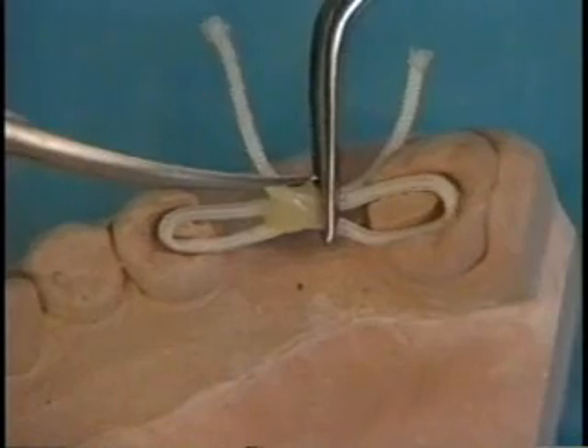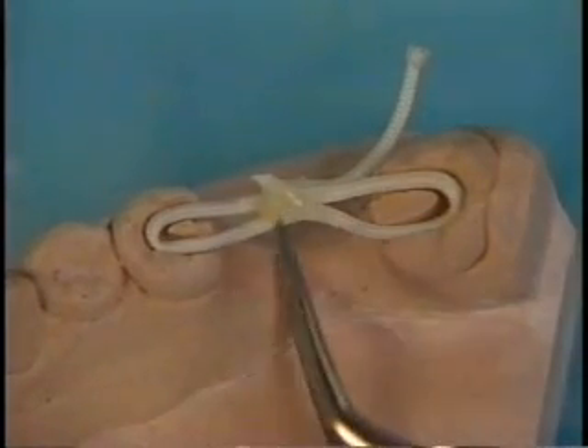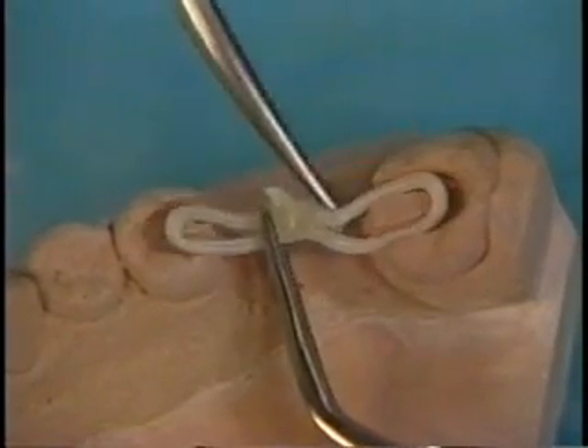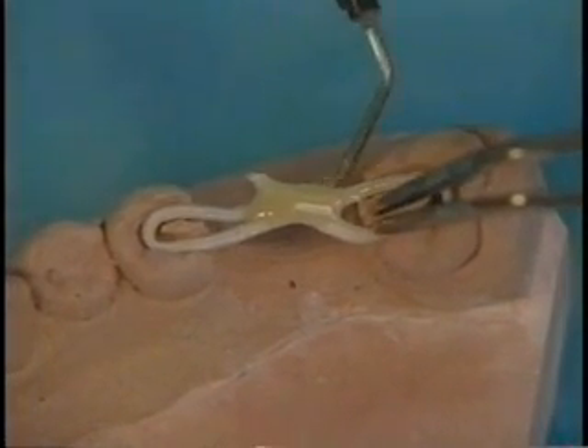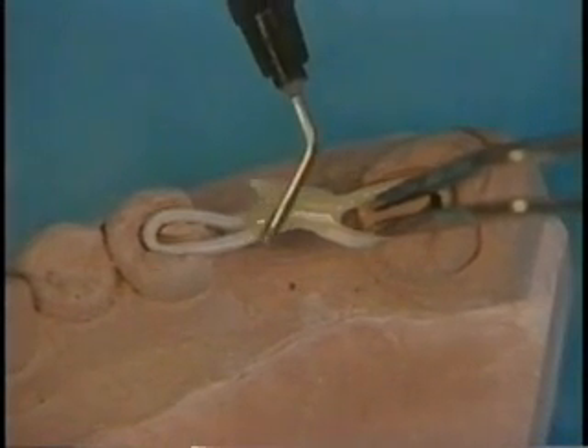Cut away the excess ends of the glassband. The portion of the glassband to receive the pontic is also treated with the previously mentioned resins and light cured.